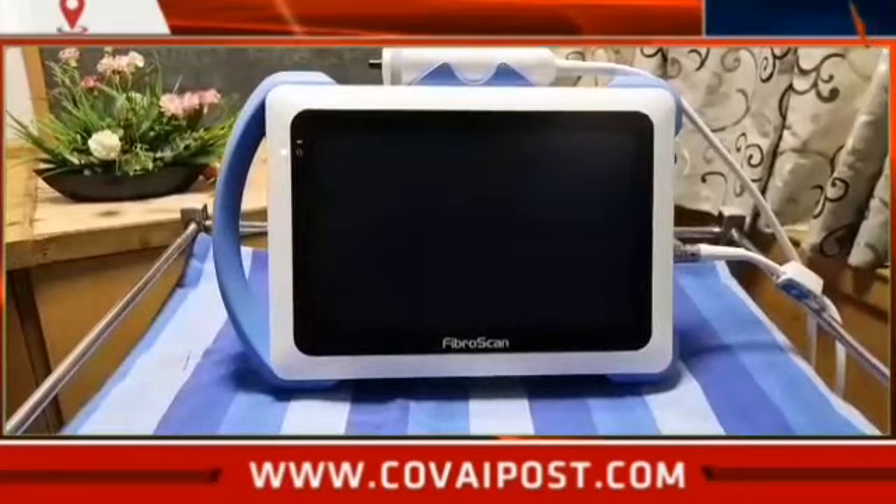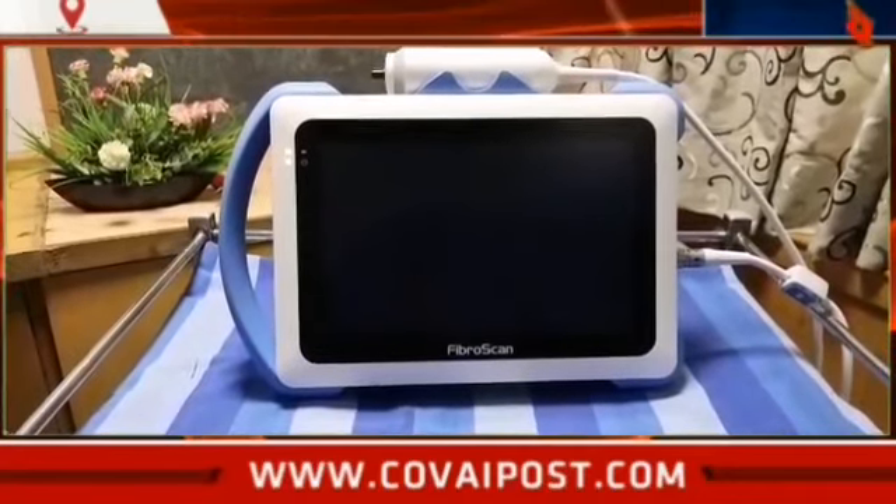So we just launched it now. The advantage of the FibroScan machine is its speed. The FibroScan is used to assess whether the liver is soft or stiff — and that is why it is important.